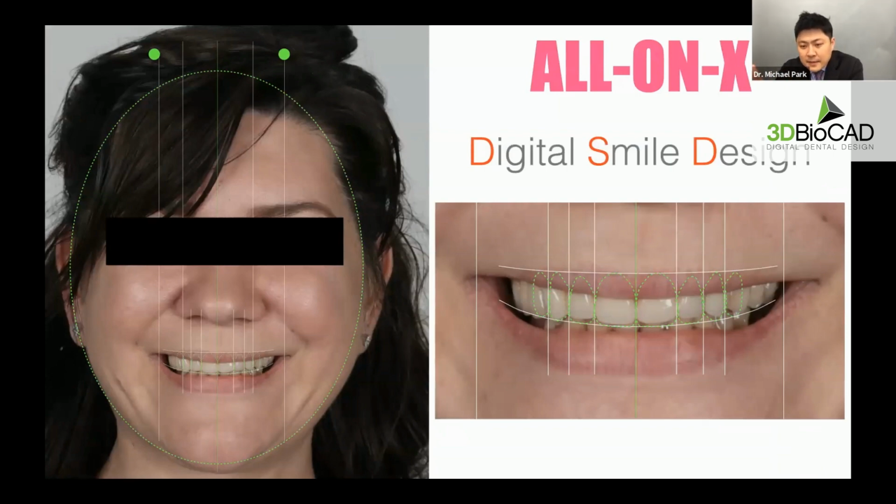Like I said in the beginning, I wanted to improve the patient's smile, so I did a digital smile design. Here, I think I used the Keynote software on my MacBook Pro, but now 3Shape has smile design software, so we can use that.